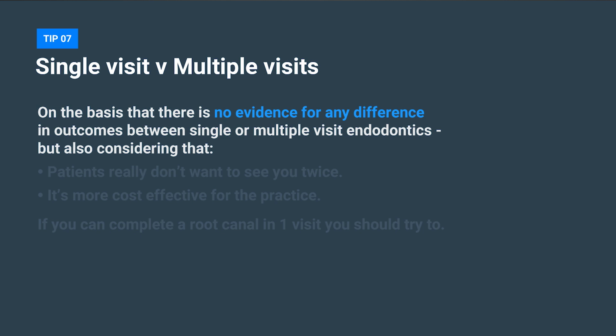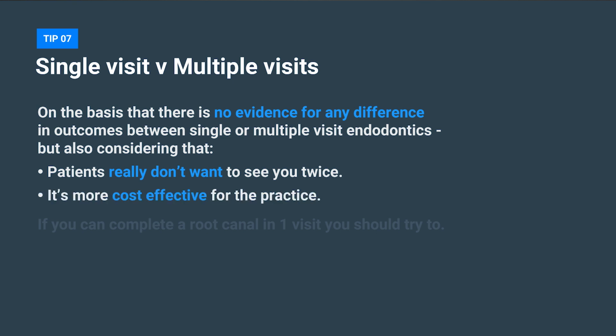Given that there is no evidence for any difference in the outcomes between single or multi-visit endo, but also considering that as lovely as you are, your patients don't really want to come and see you twice, and also it's much more cost effective for the practice, if you can complete a root canal in one visit, you should try to.